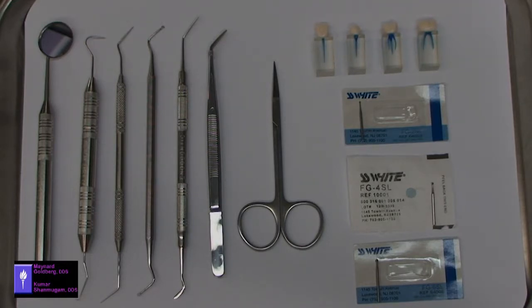It must allow for straight line access to all the canals and for the free, unimpeded movement of the canal instruments. The coronal tooth structure should not interfere with these instruments. If you cannot see the canals, you cannot treat them.